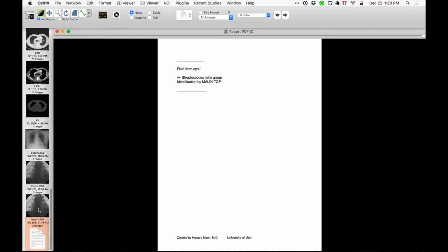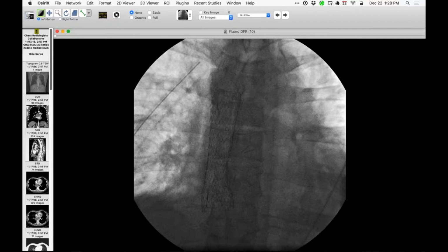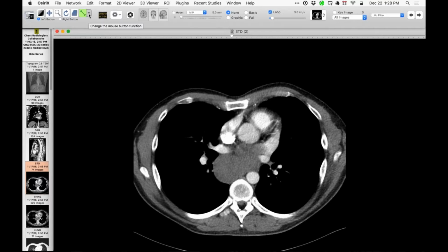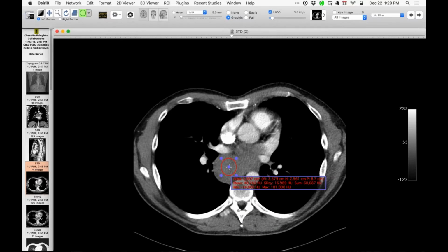So, you know, he's not doing well. Eventually he had the surgery, and the most recent thing is he has a stent there to try and close the hole between the esophagus that still persists in the lesion. So this is not a solid lesion. If we go back there and do the usual thing and measure things, the numbers are relatively high, as in 48 and so on. But this isn't a solid lesion. It was described as solid, but isn't. So presumably pretty proteinaceous. But you can see what happened. So that's kind of scary. So one really has to watch out.